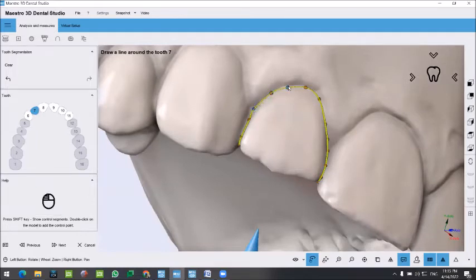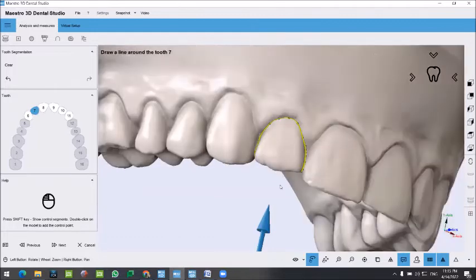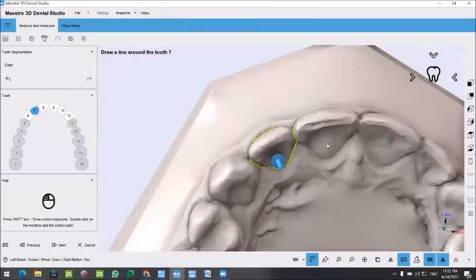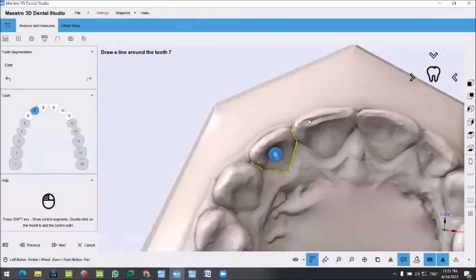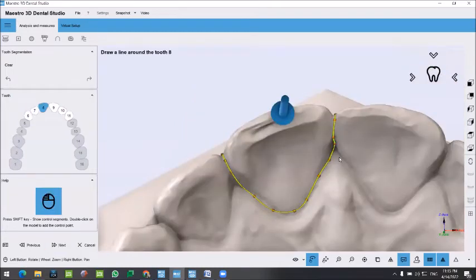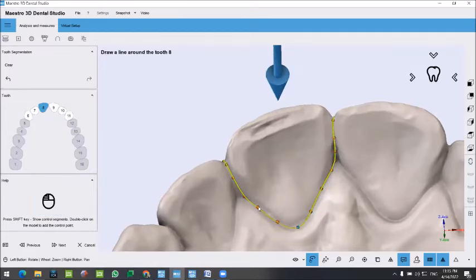I always tend to look at the pictures to see, for example, if we have an anterior open bite, which arch I'm going to extrude more. If I have a gummy smile, for example, which arch I'm going to intrude more. So I always tend to look at the pictures to try to reach a good decision on what to do exactly with this case.